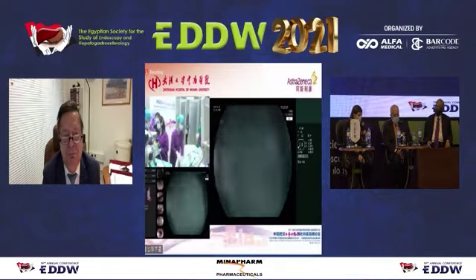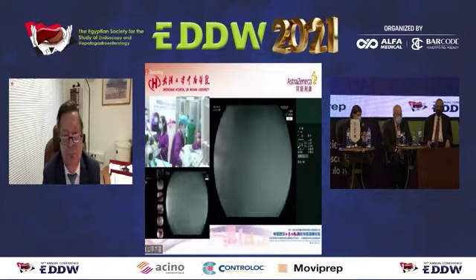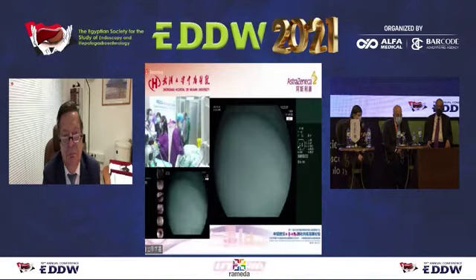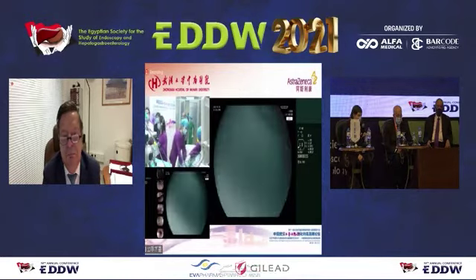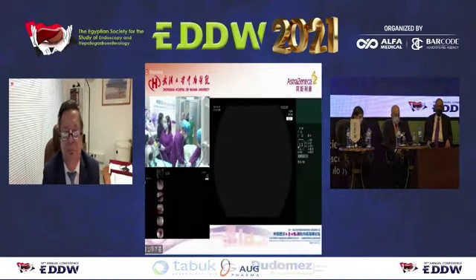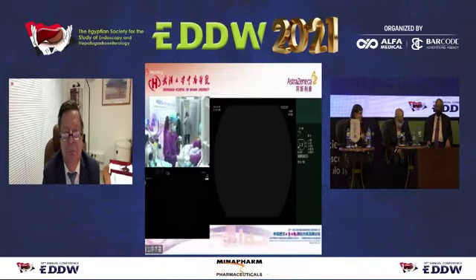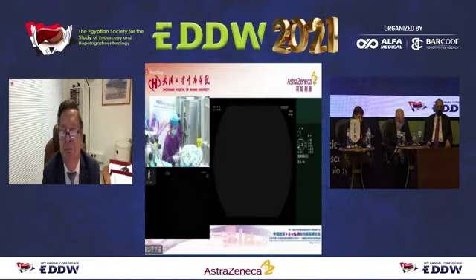So we have finished the examination, and we can see from the AI system that we have detected all the esophagus and stomach. You can see the stomach and esophagus become red. The blue color means we didn't detect it, we didn't take any picture. Thank you very much. Very good. Thank you.